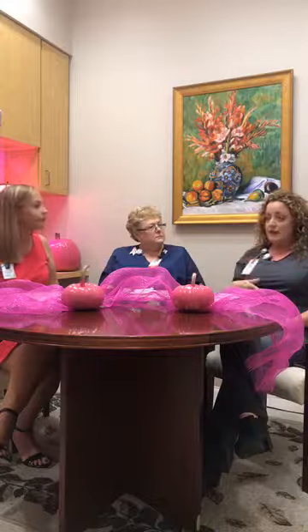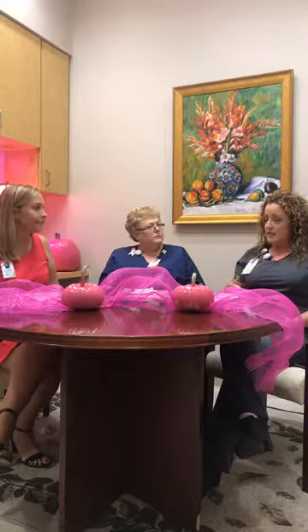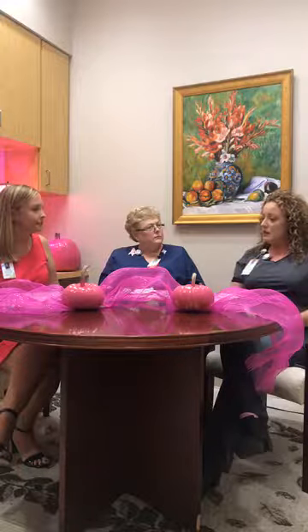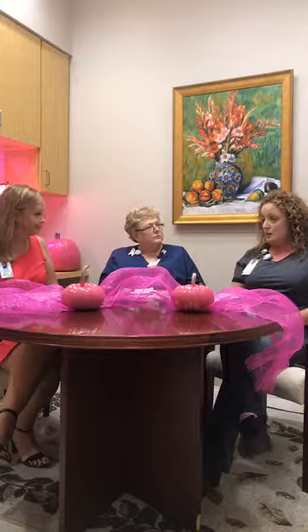And you don't want to have to come back and see me for what looks like calcifications, and I'm doing additional views and it's deodorant. So if you do wear it and you do come in, we have wipes. Just remind the tech that you've got your deodorant on, and we'll give you something to remove it. Those are 2 things that you want to make sure we remove if you have them on, or if you just want to bring it with you and put it on after the exam, that's fine also.